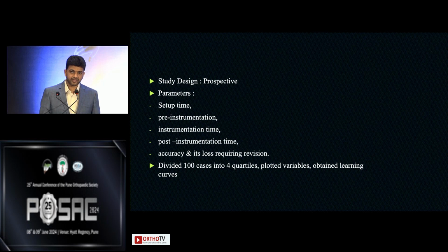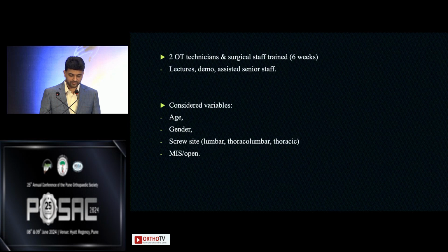We divided the 100 cases into 4 quartiles and compared outcomes of each quartile progressively. For this, we trained 2 OT technicians and 2 surgical staff for a period of 6 weeks with demos and lectures, and they assisted the senior staff first before starting the cases. Considered variables were age, gender, screw site, and the surgery, whether it was minimally invasive or open.